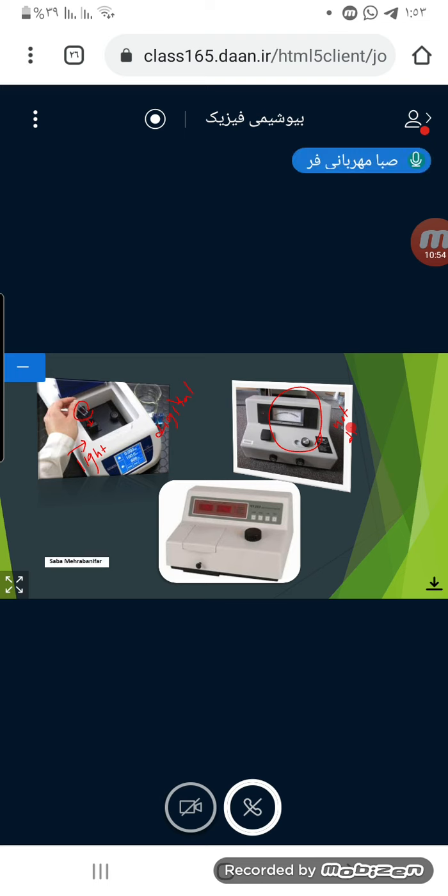Yes, we're using it in hospital laboratories to understand the concentration of, for example, protein, lipid, triglyceride, cholesterol, sugar, yes, different sugars like glucose, urea, yes, urea, and different kinds of macromolecules.